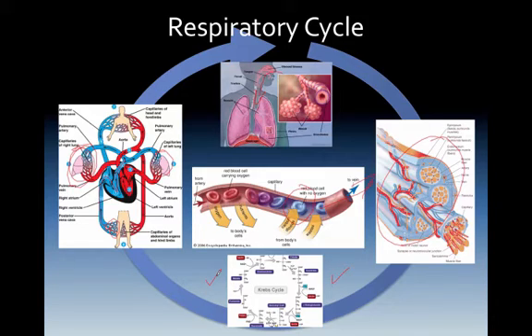Now the end-tidal CO2's part in this is it takes a look at the CO2 that is expelled and will give us an overall look at this entire process. Are you moving red blood cells through the system appropriately?